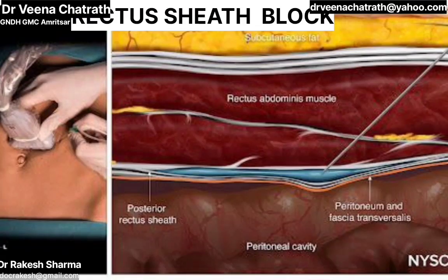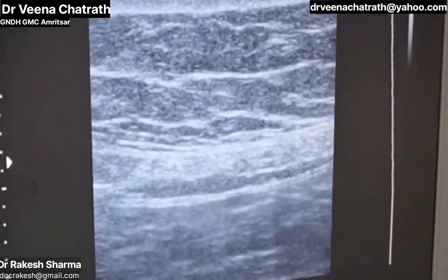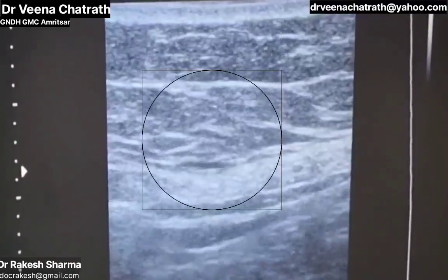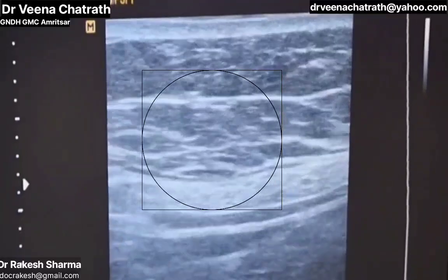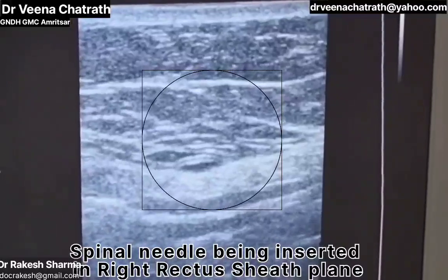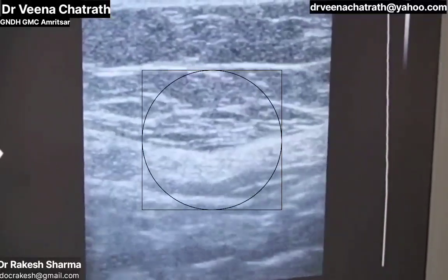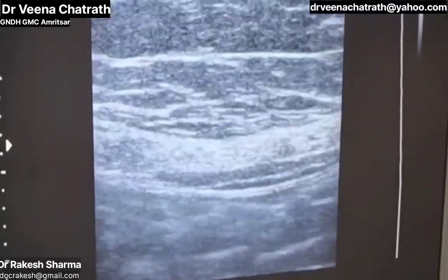Now the needle is being introduced. As we can see, the entry of the needle in the in-plane technique. So we can see that the needle is being introduced, and now it has pierced the rectus muscle. Hydrodissection is being done to confirm the position of the needle with 2 ml of saline.